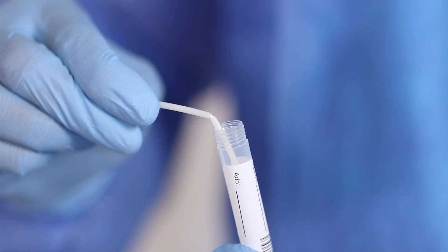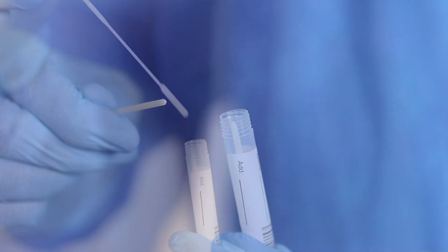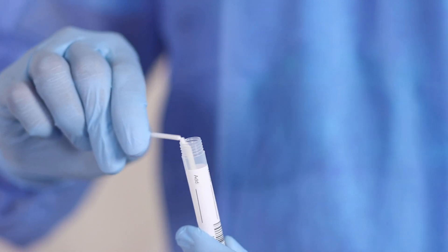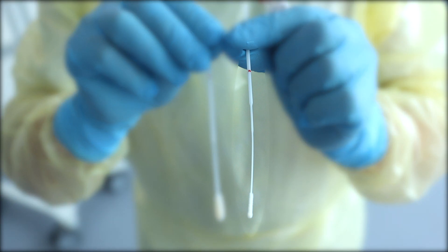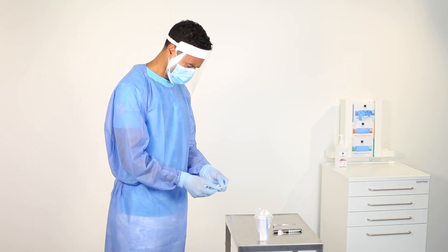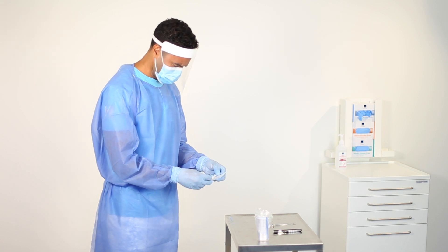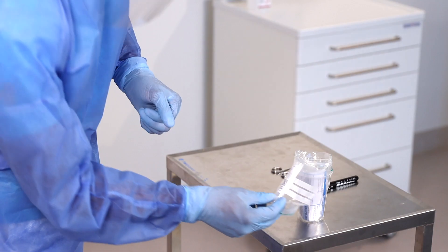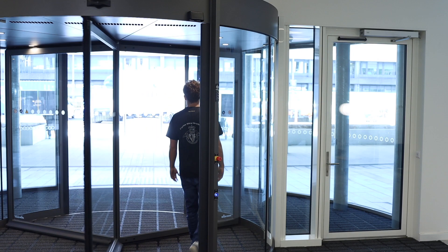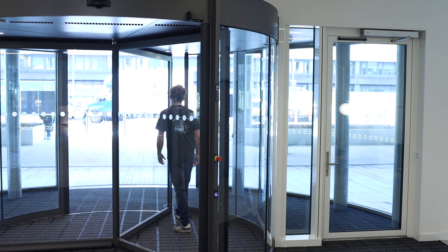In order to save equipment, the same specimen collection vial with viral transport medium may be used for both the nasopharyngeal and the oropharyngeal swabs, and the same swab, preferably one with a flexible shaft, may even be used to collect samples from both sites. Ask the patient to put the medical mask back on, verify that the specimen collection vial and the form are correctly labeled and match the patient's identity before the patient leaves the room. Ask the patient to perform hand hygiene, either with alcohol-based hand rub or water and soap before leaving the test area.